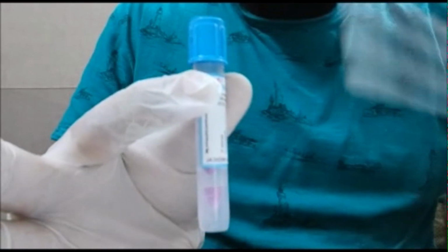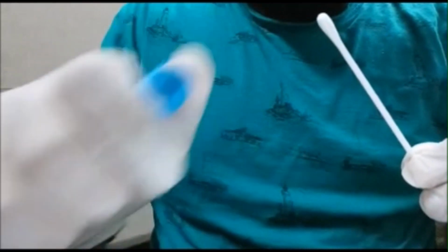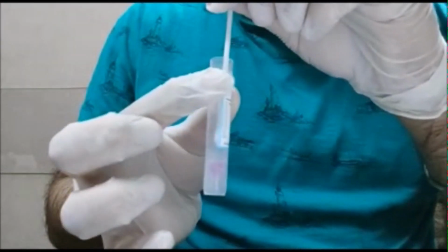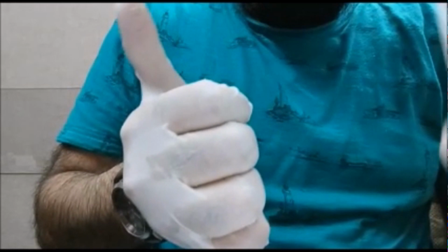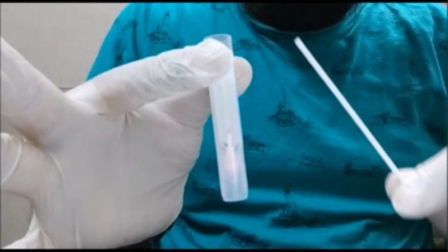Let us consider that this swab has already collected the specimen. Just place it like this. Use your thumb and index finger. It breaks. See, it simply breaks.